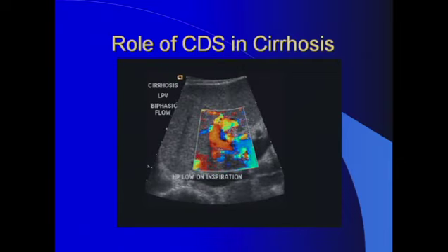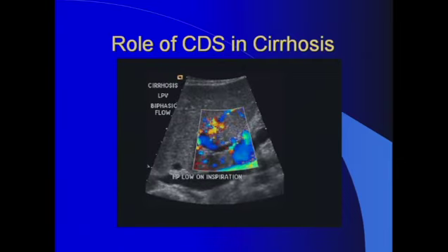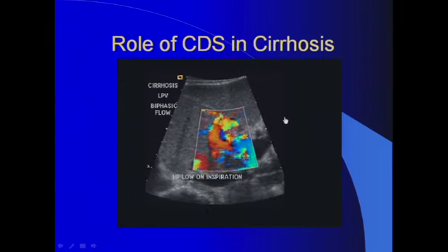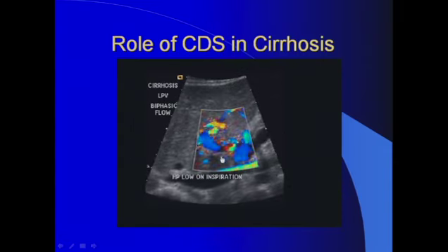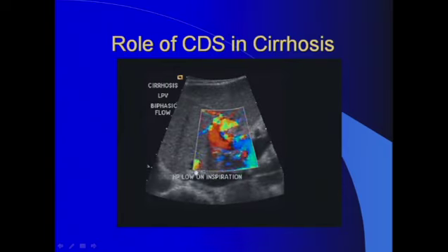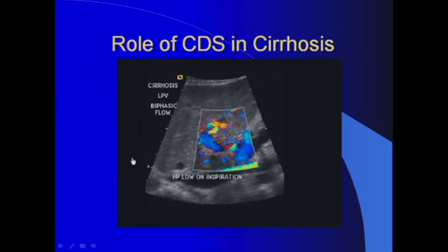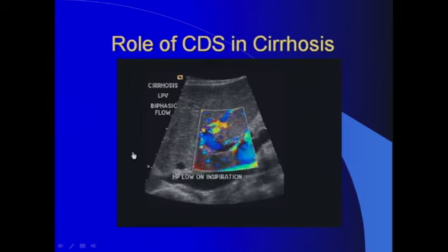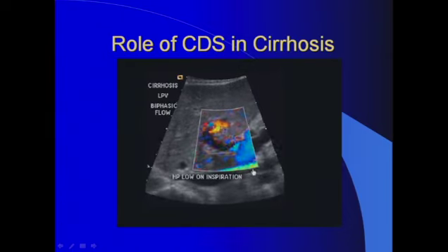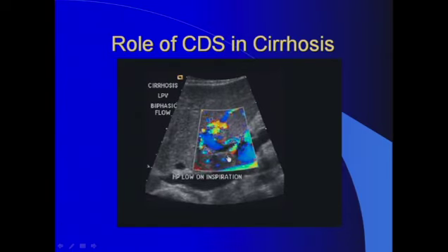So let's review some of these images and video clips. I really recommend that evaluating this physiology be performed in real time using video clips, or by personally scanning the patient in real time, to make sure you evaluate the blood flow to the liver, the portal vein, and the hepatic artery.